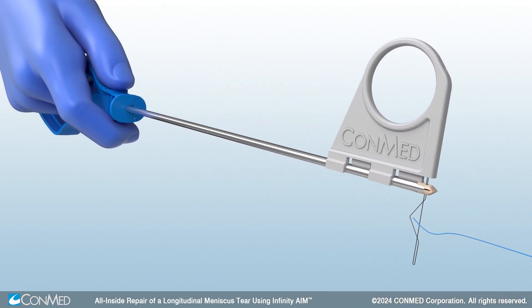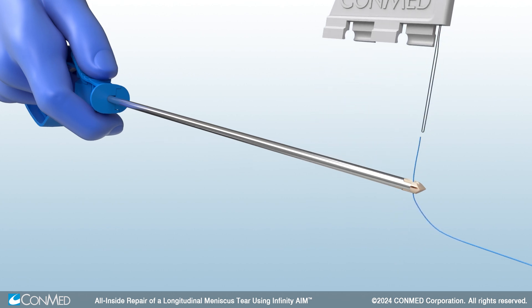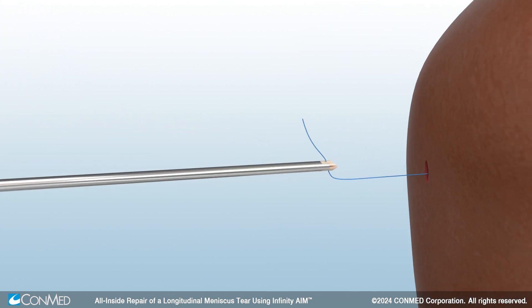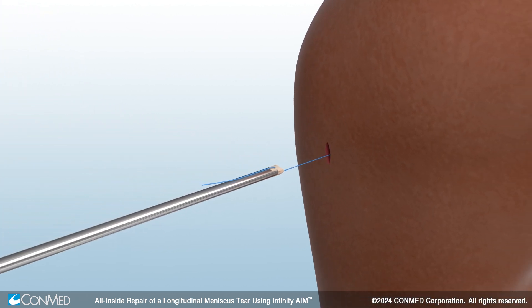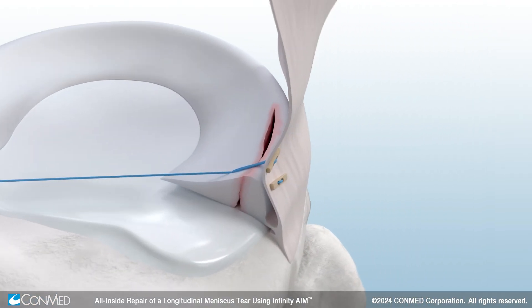Load the blue 2-0 suture tail into the Aim suture cutter threader, and then pull the gray tab to load the suture through the eyelet of the cutter. Insert the cutter into the joint in the same orientation as your incision and follow the suture down to the implant location.